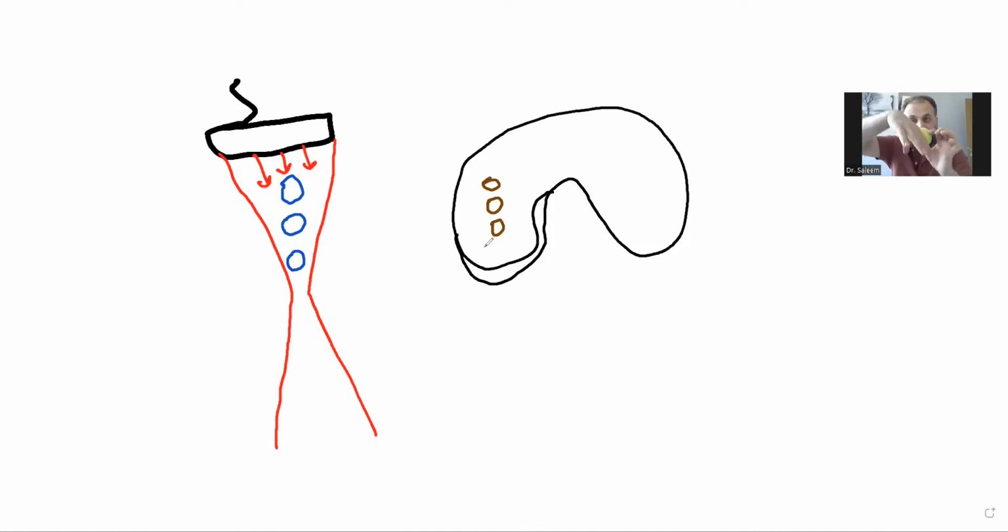Now, the beam goes inside of this. So all three of them are parallel to the main axis beam, but among themselves, they are behind each other. We can say front and back. For example, nodule number one, nodule number two, and nodule number three. Nodule number one, pretend, is a little bit superficial, a little bit shallower compared to nodule number two. And nodule number three is the deepest one. So pretend that the sound pulses are coming from this portion.